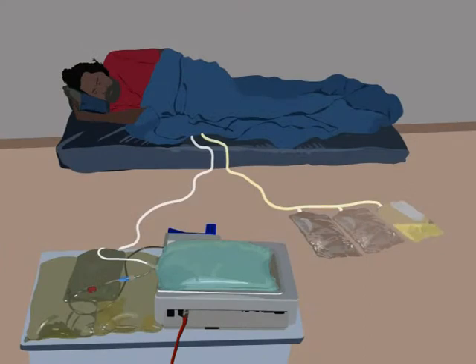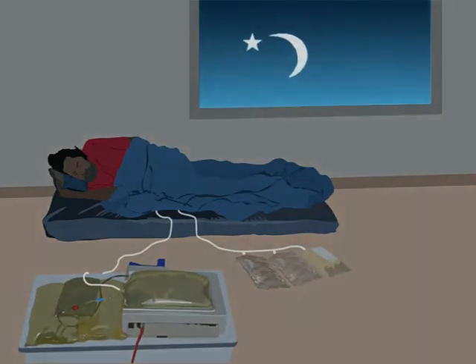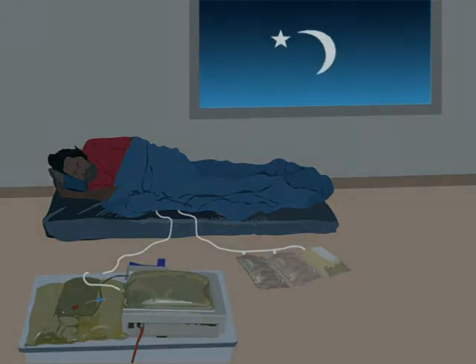While you are sleeping, the machine will let the used water go out to empty bags, and cleaning water fill up into your peritoneum. You will need to be connected to the machine and bags for 10 hours overnight every night.